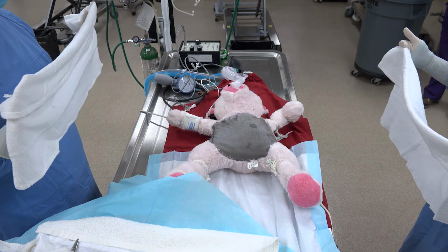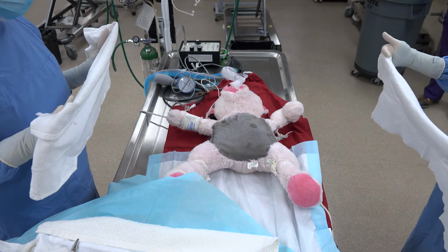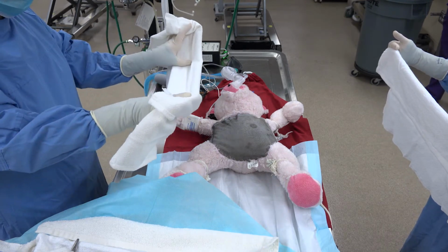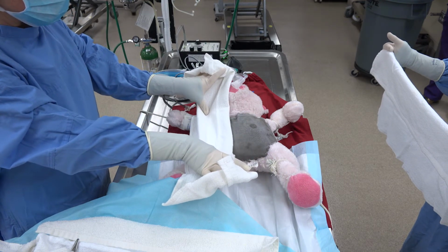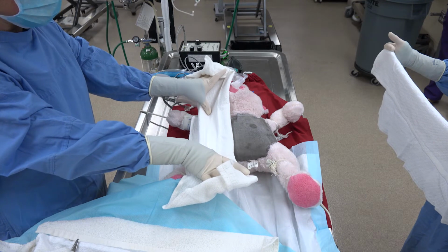So now that I'm ready with my hands, I have my drape ready. What I'm going to do is aim for the middle and then go out. So you can start in the middle and pull your drape out, but you cannot go from outside in, okay?